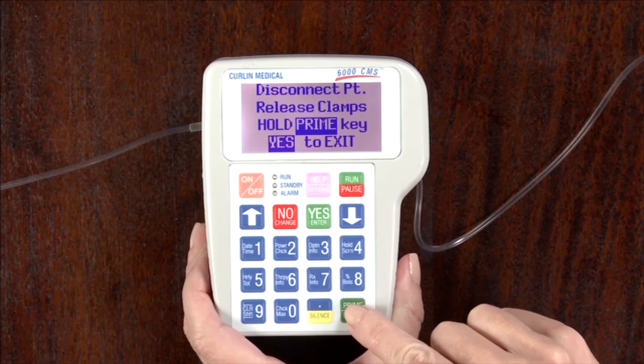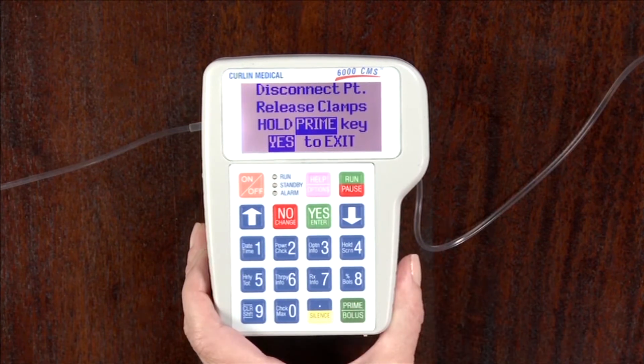After pressing it once, the screen will read: disconnect patient, release clamps, hold prime key, yes to exit.